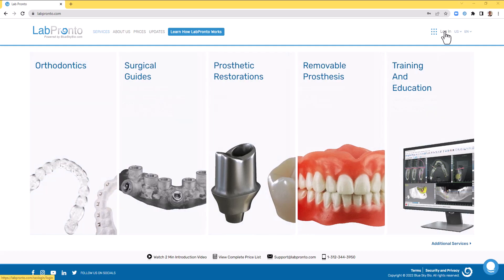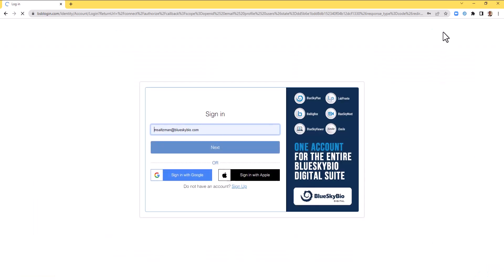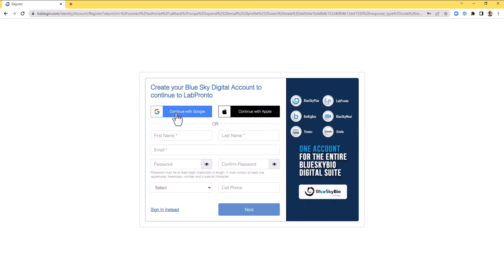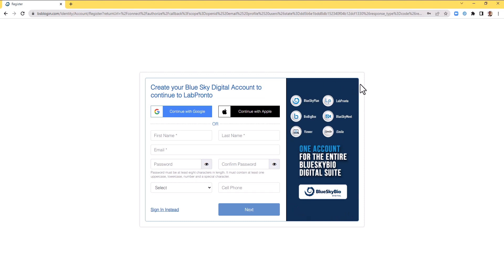If you don't yet have an account, then simply click sign up. You could continue with Google or with Apple with a simple click, or you could enter your details and create a username and password. And as I mentioned, you can use the same login information to the entire BlueSky BioDigital suite.